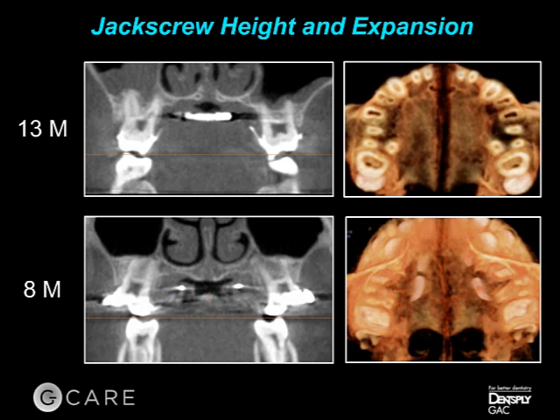Look at the sutural change of the 13-year-old versus the 8-year-old, and look at the dental tipping that happened in the 8-year-old versus the 13-year-old. This really goes against conventional wisdom of expansion, which says you would think that the 8-year-old would have more skeletal change versus dental tipping, and a very effective expansion. But that's not really the case.